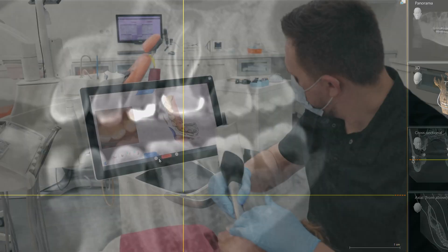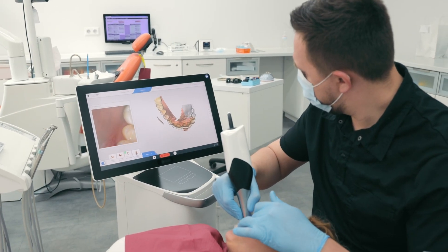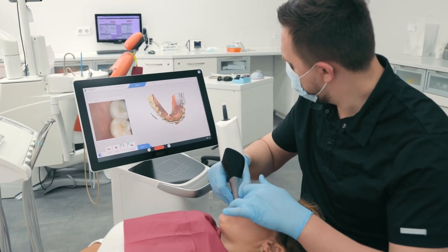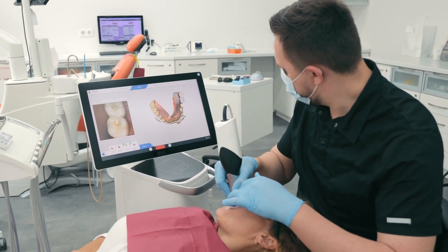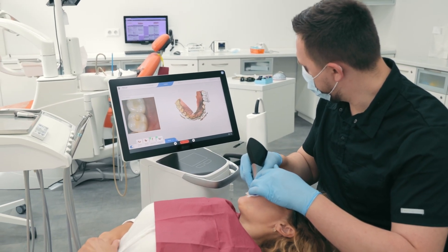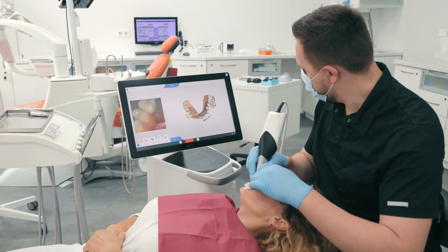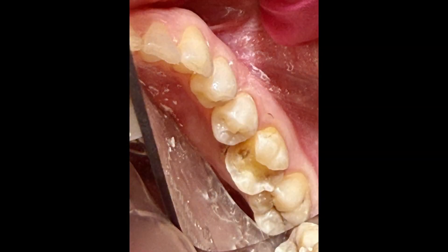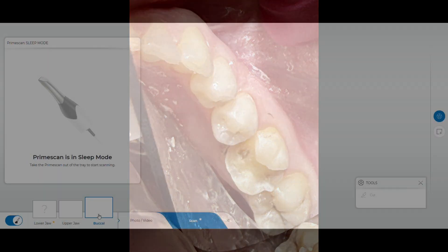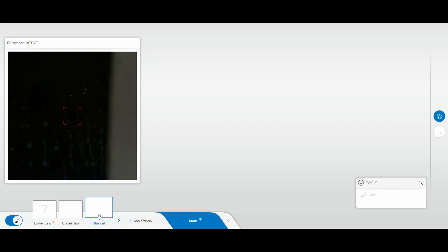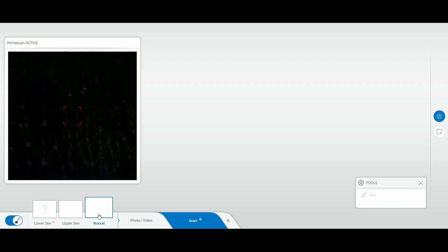We used this awesome piece of technology called the CEREC machine to prepare her tooth for a partial crown. Note that when we did this tooth, this is not a traditional crown prep where you cut all the tooth structure off. One of the great advantages of using the CEREC machine is that I can be minimally invasive — saving healthy tooth structure, only removing what's bad, strengthening the tooth, and leaving all healthy structure intact.